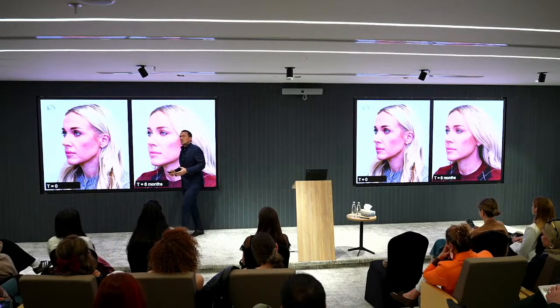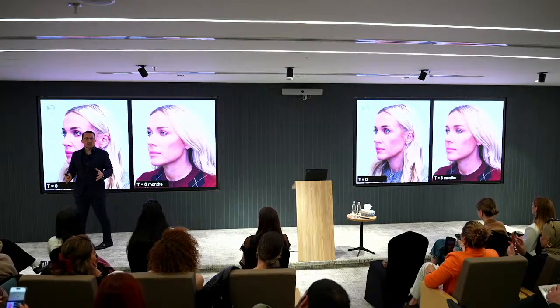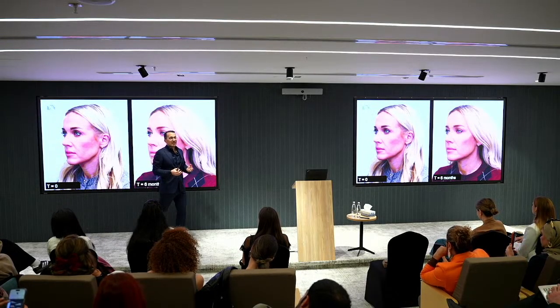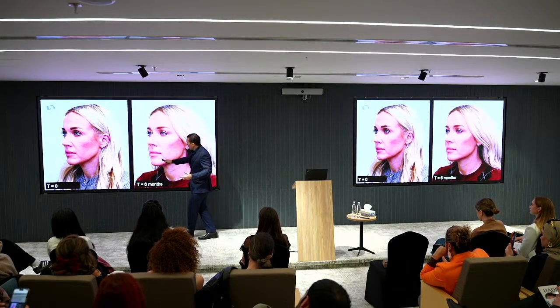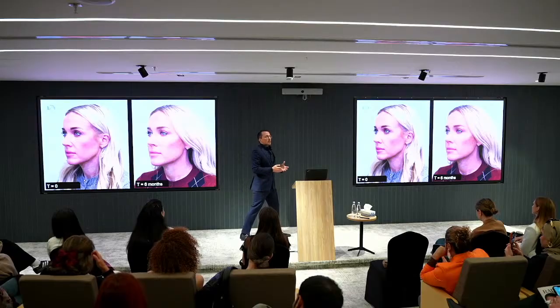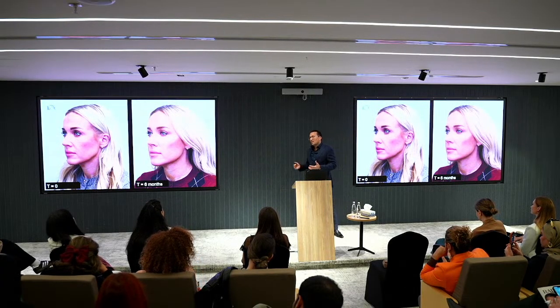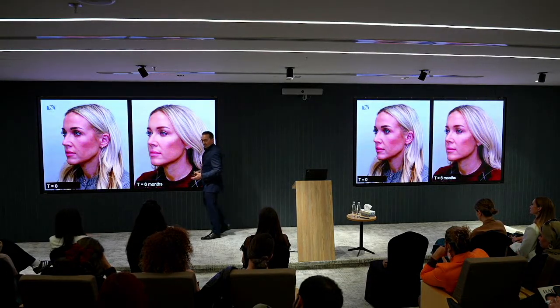Compare intense to volume. Volume is an amazing volumizer. It attracts a little bit more water than intense. Might give a bit more puffiness here and there. Here I treated the jawline, around the chin, no puffiness, nothing. Super straight. So intense is also a product which resembles, for example, Radiesse the most. So for me, if I need an alternative to Radiesse for some reason, I would always grab intense.